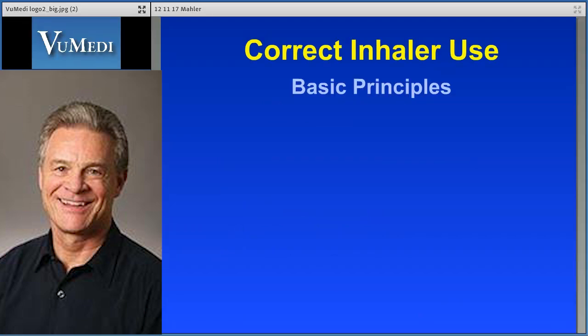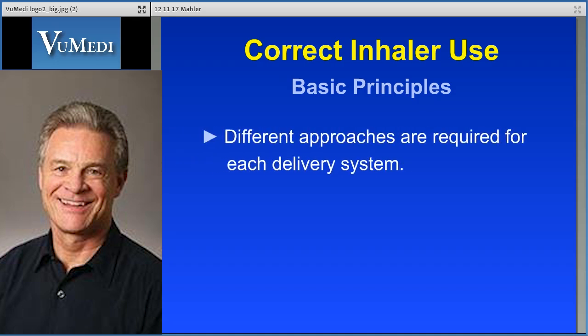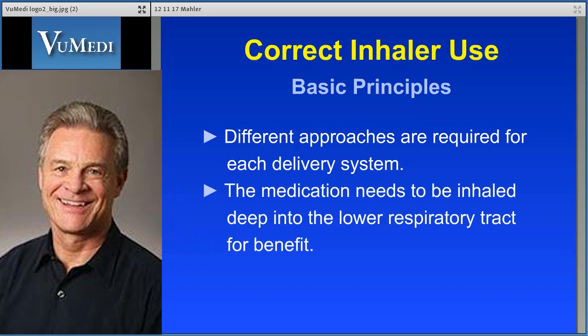So the 2 basic principles on correct inhaler use that I will be promoting in this presentation are that different approaches are required for each delivery system, and the medication needs to be inhaled deep into the lower respiratory tract for benefit.